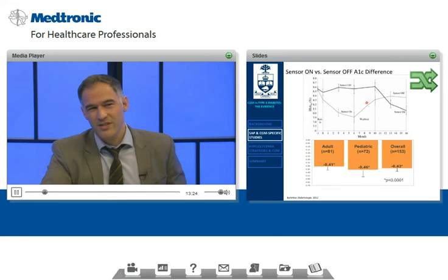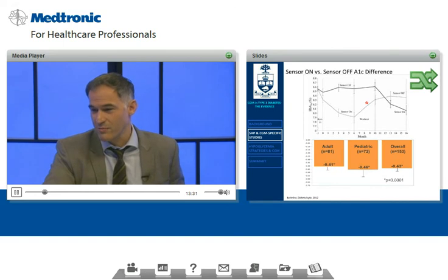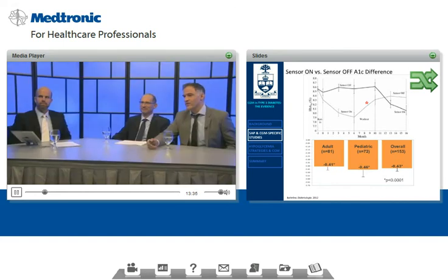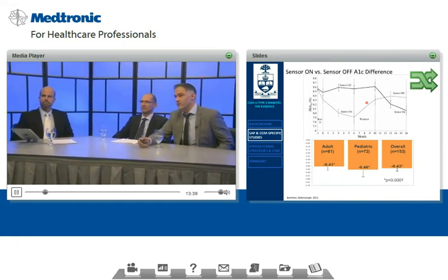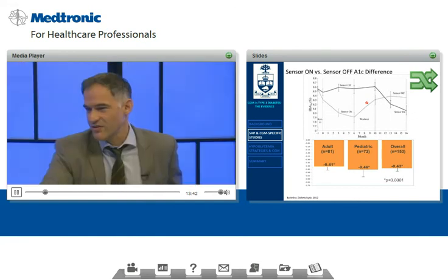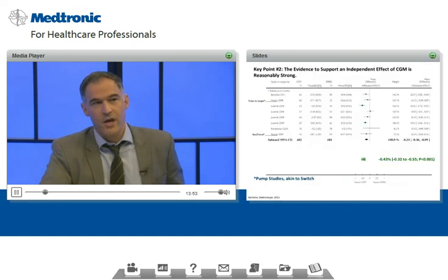But one of the key points of this study, if you look at that washout phase, for me, in my heart of hearts, I believe that if someone's on CGM for 6 months, that they're going to learn things about it. They're going to learn about basal rates and how to better carb count and learn about insulin dosing. And then that's going to pay off even when they're off a sensor. But there's not great evidence that that's true from this study. Once someone's off a sensor, their glycemic control worsens or rises again.